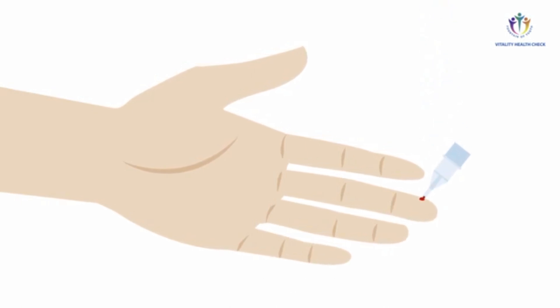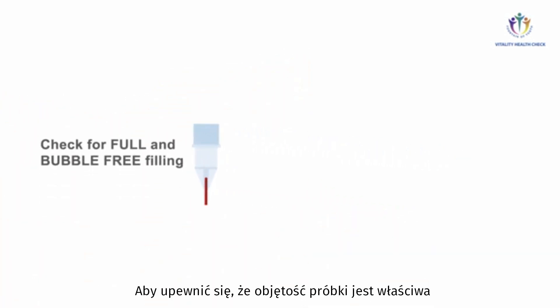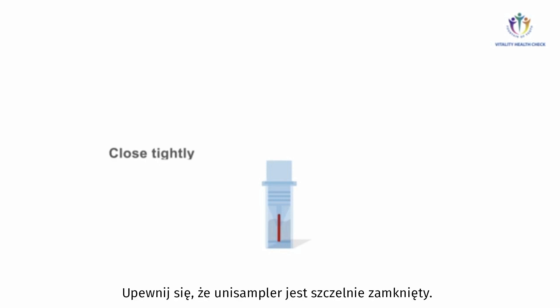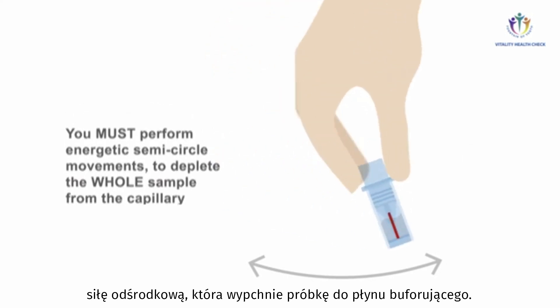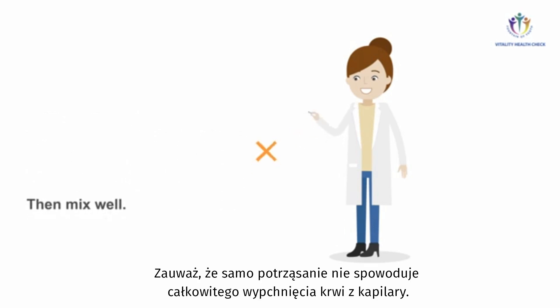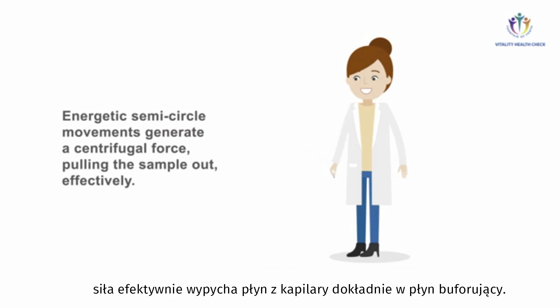Wait until the second blood drop has achieved a size of about two to three millimeters, then touch the blood drop slightly oblique with the capillary of the blood collector so that it fills in one go. Check for full and bubble-free filling of the capillary to ensure the sample volume is exactly correct. Insert the blood collector with the end-to-end filled capillary onto the prepared collection tube and make sure the unisampler is closed tightly. To deplete the sample from the capillary, perform energetic semicircle movements to generate a centrifugal force pushing the sample into the sample buffer, then mix well.